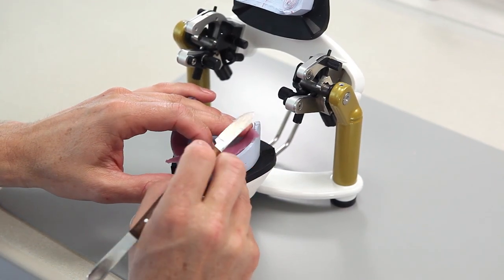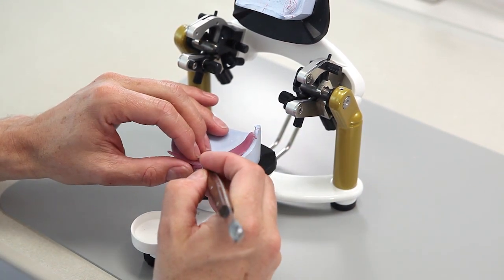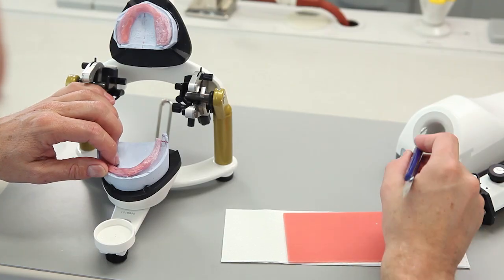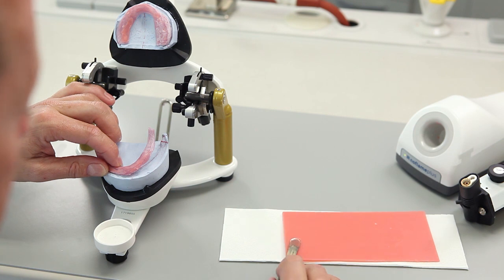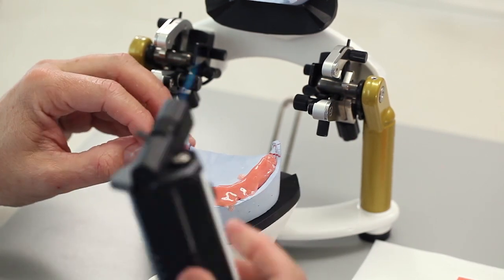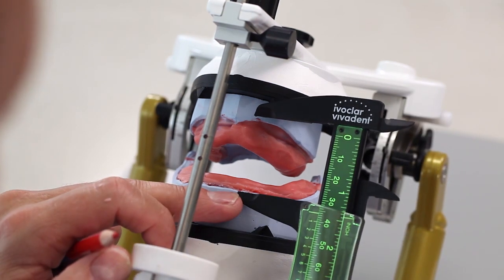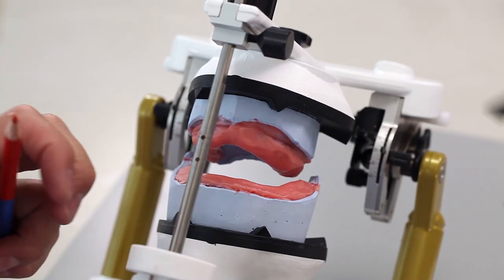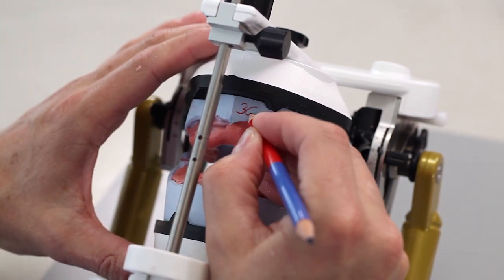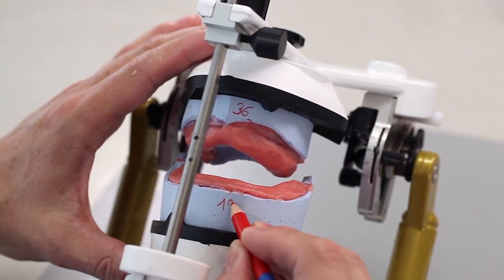Precise and stable resin plates made of tray material facilitate the try-in and prevent deformation. Ideally, use a hard wax with a high softening point for setting up the teeth. Determine the intervestibular distance and note down the value measured on the edge of the maxillary model and half the value on the edge of the mandibular model. In this way, you determine the position of the occlusal plane in the anterior region.